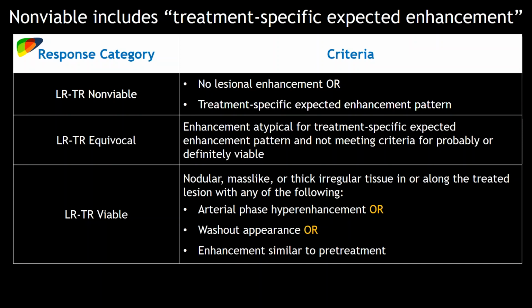And so the way I will sometimes present it is, based on this imaging appearance, it looks like they had intra-arterial therapy. If it is radiation therapy, then I would call this equivocal, but if it was non-radiation, I would call it non-viable. Like we were talking about with that other TACE case, in your reports you could add that caveat: if it was this form of therapy, this is what I'd call it; if it was another form, this is what I would call it. But I really can't make an accurate assessment until I know what form of therapy it was.